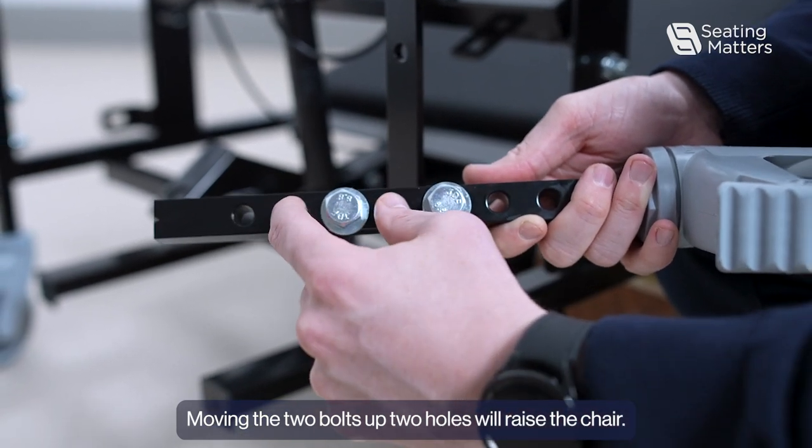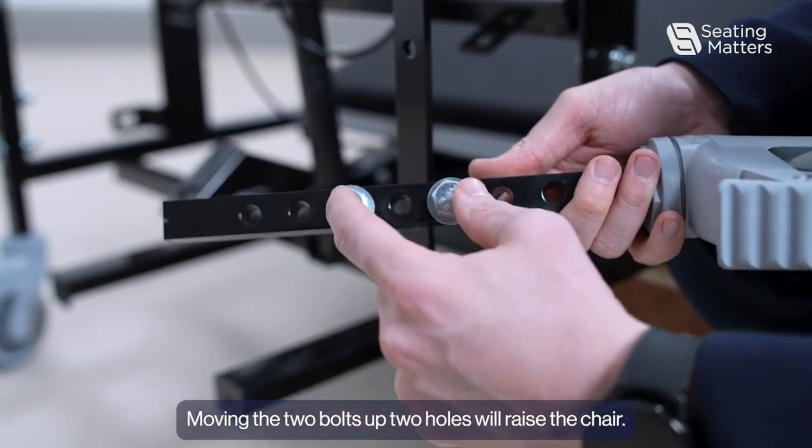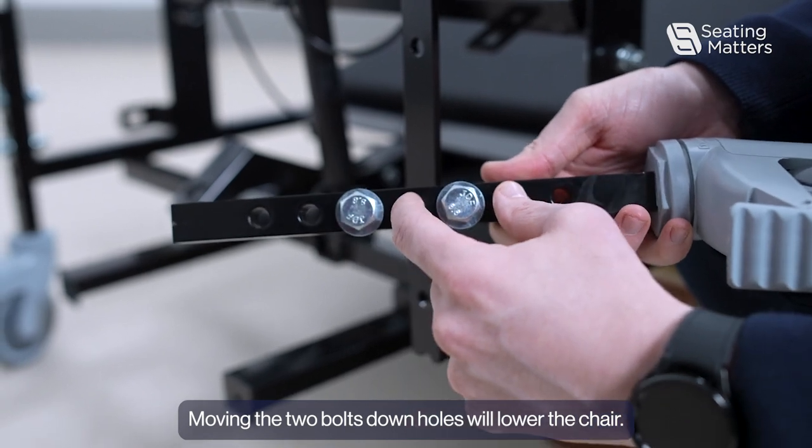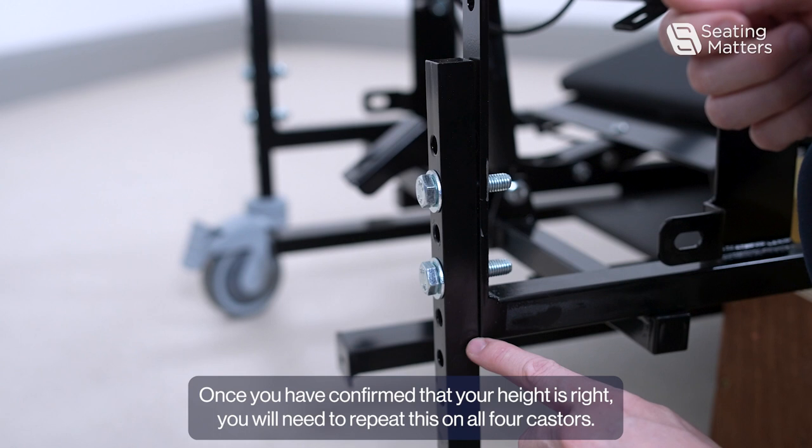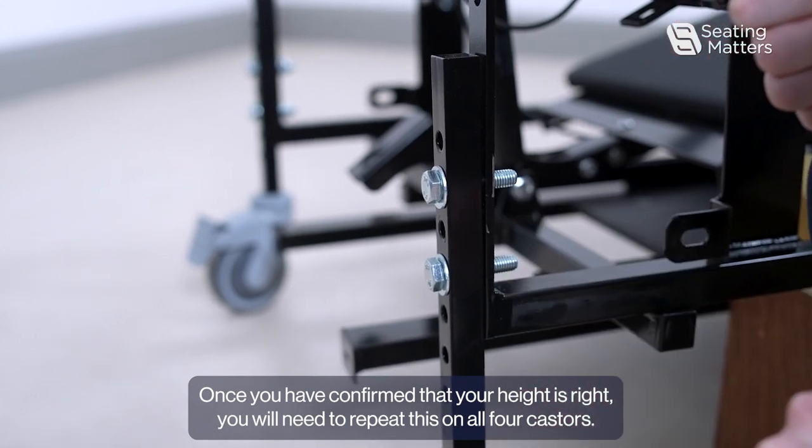Moving the two bolts up two holes will raise the chair. Moving the bolts down holes will lower the chair. Once you have confirmed that your height is right, you will then need to repeat this on all four casters.